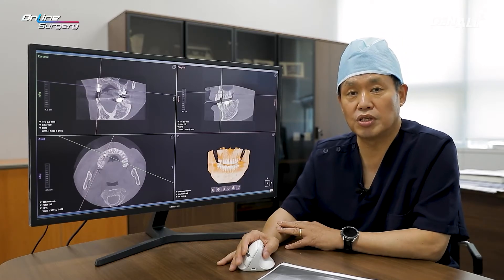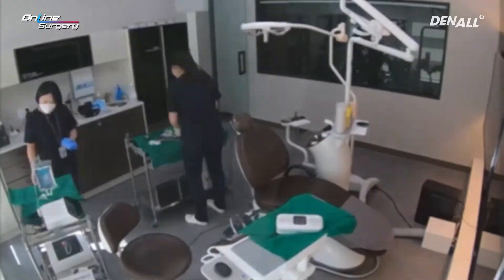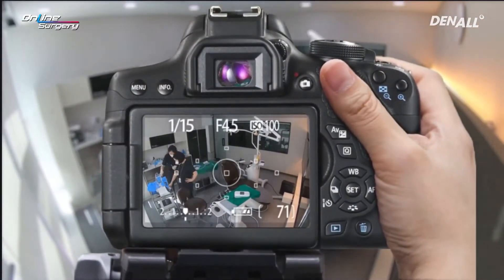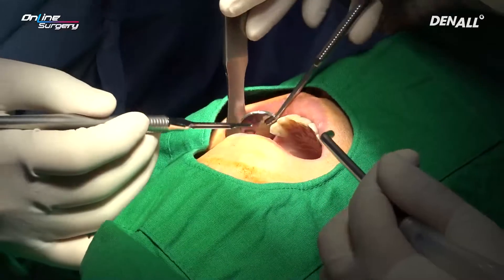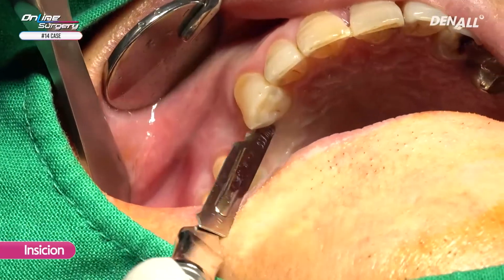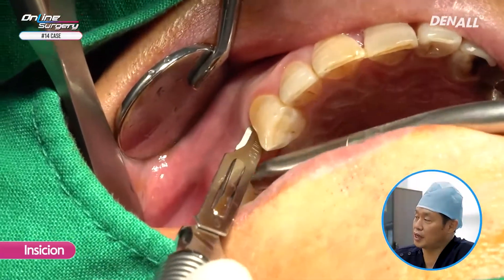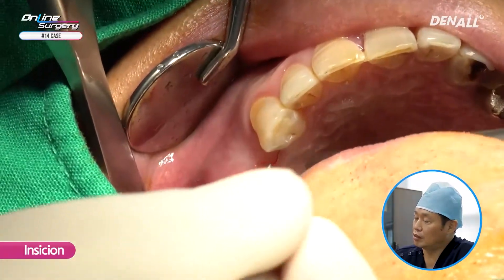This was fairly simple surgery. Let's look at the surgical video clip. This is an upper premolar and I plan for a palatally inclined implant placement.